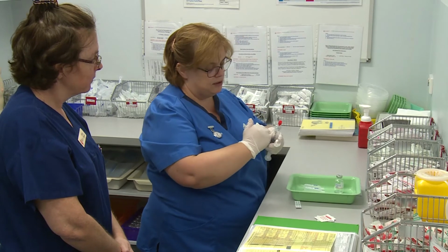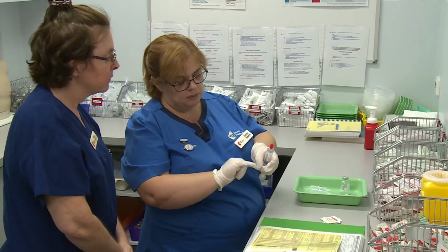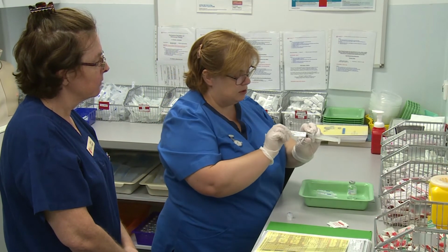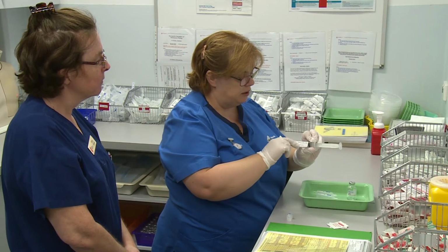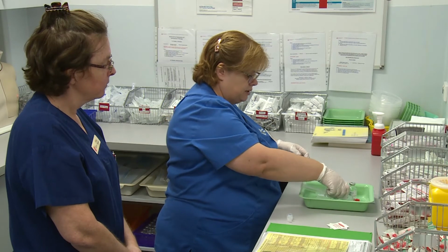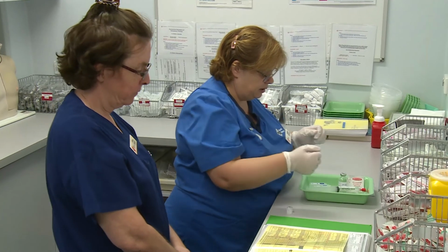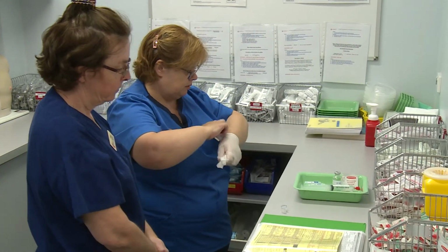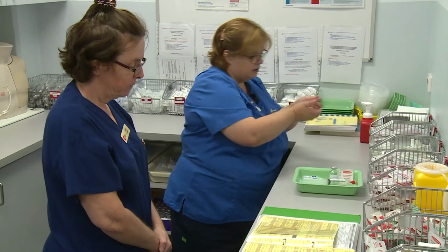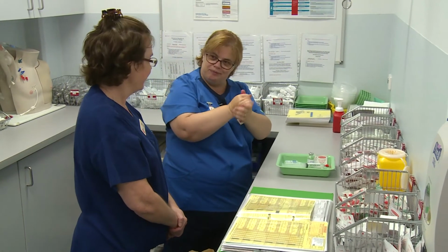Okay, so I can't put this syringe down until I have a label on, so this is my label that I prepared earlier. So you agree that it is amoxicillin 1 gram. Yes. And I'm just going to put this so it doesn't cover up any of our graduations on our syringe. Great. Right, you happy to do a final check or a second check? Yes. Okay, so now I've prepared our medication. We will do our second check. Let's do my hand hygiene. And then once we've done our second check, we'll go to the bedside. Great. Thank you. Thank you for your time. So be patient.